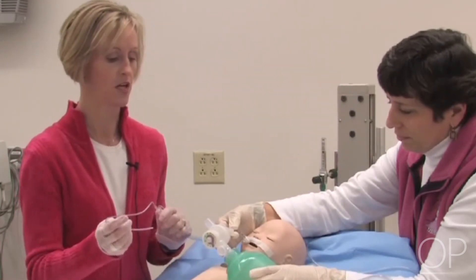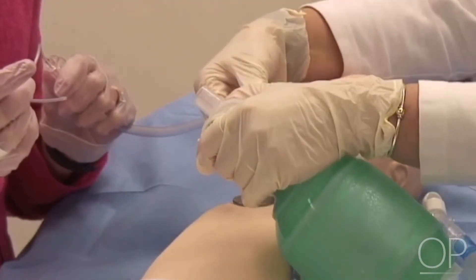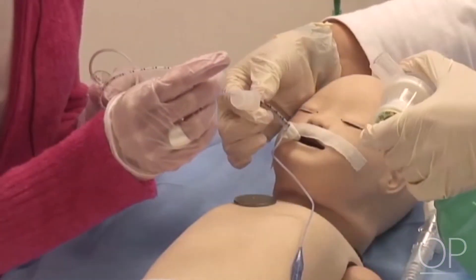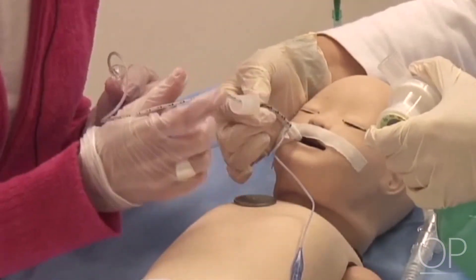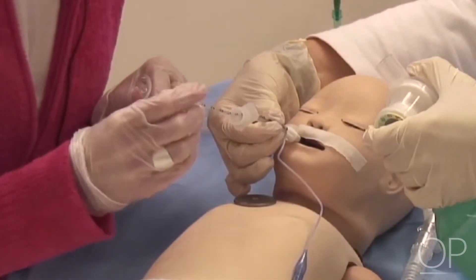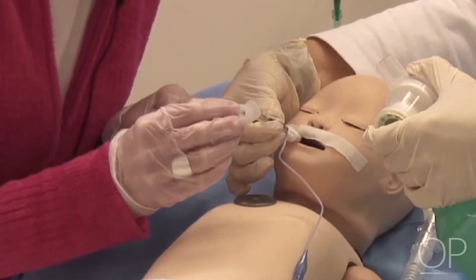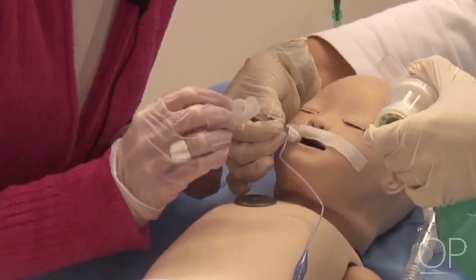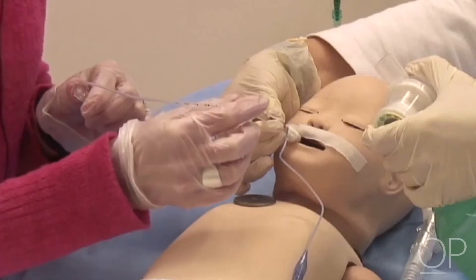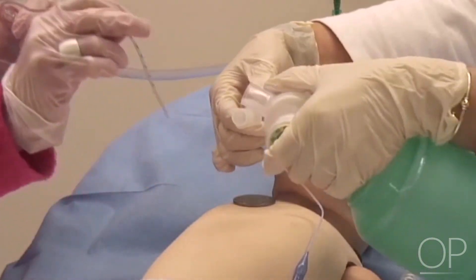We'll pass it one more time to make sure we've rid the tube of any secretions. I line up, make sure I go to the proper depth, apply suction, and remove.